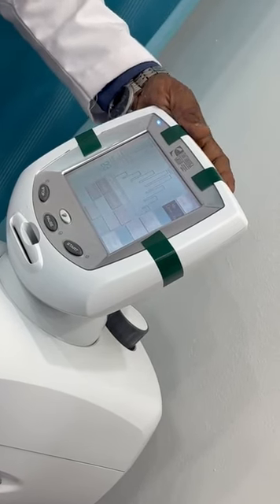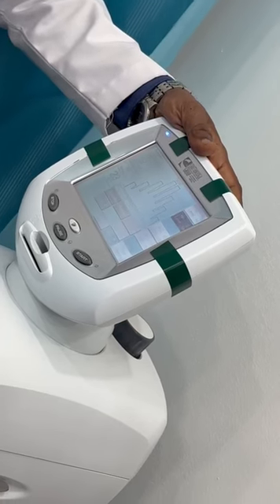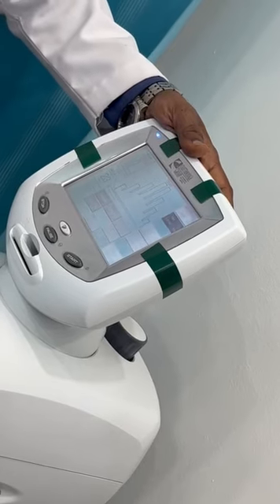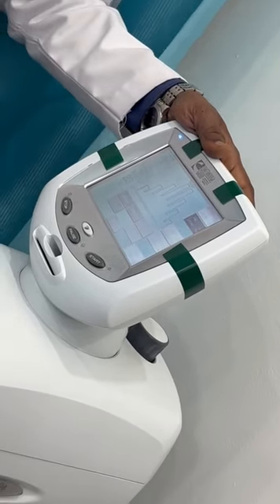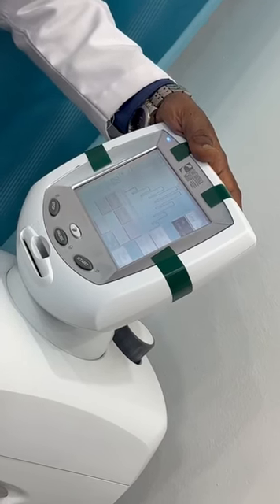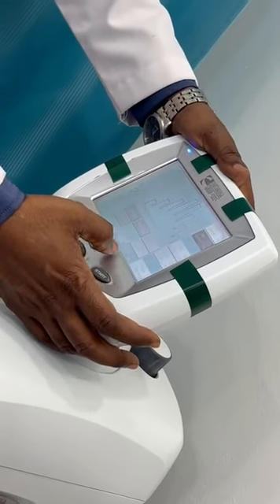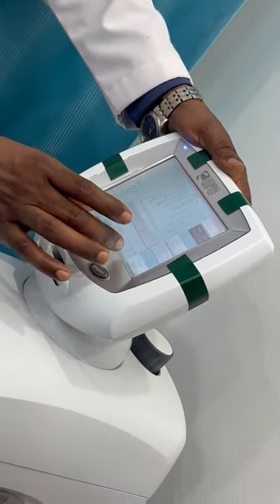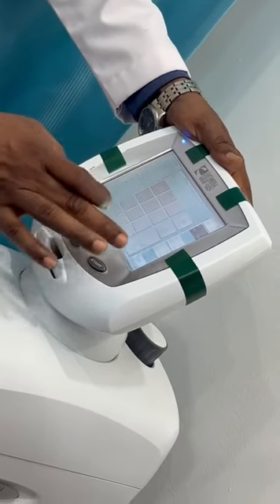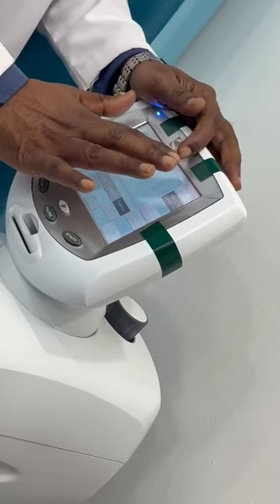For example, if you want to do continuous traction, but instead of keeping 1 step, we can keep 3 to 4 steps, 2 to 3 steps. It's almost like continuous traction. Instead of keeping the 8 kg throughout the treatment time, we can keep 4 kg, 6 kg, 8 kg. Then time also you can set. Progression time usually we keep similar. For example, if you keep this one only 1 minute, progressive traction will have more timing.